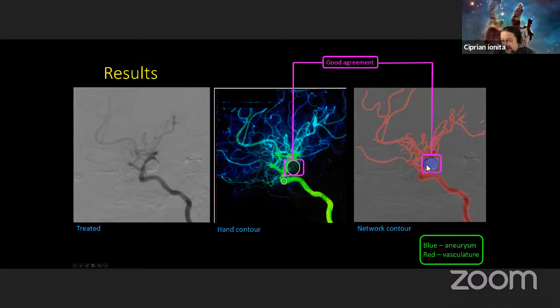I would say the AI actually is better because it doesn't do this kind of circular placement. It goes and identifies the edges. And if there is a slight motion artifact, it is okay. It is not being thrown away. In this case, this patient had an intracranial hemorrhage and had a craniotomy, as you see here, with a shunt placed.